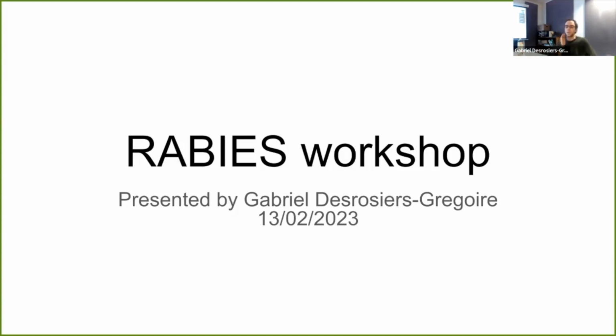My goal today is to really take you through all of the different aspects of the pipeline, give you some conceptual understanding of what the software is doing at each step, and then give you some insight into how it looks from a user perspective when you execute the software and when you use the outputs at the end, and how eventually you can make decisions to tune the pipeline to give you the best quality outputs.